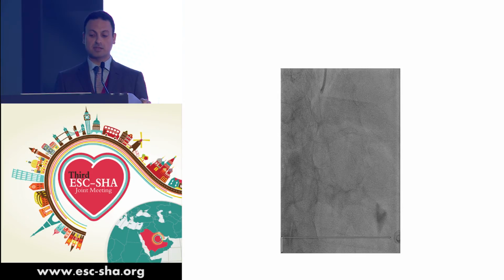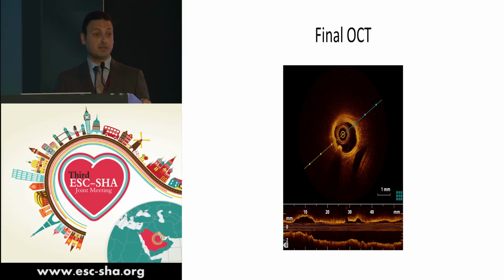The stent struts are well opened everywhere, even at the proximal edge. After this, usually I'm doing a 3D reconstruction of the stent to make sure I don't have any deformity, longitudinal stent deformity, or stent fracture after aggressive post-dilatation.